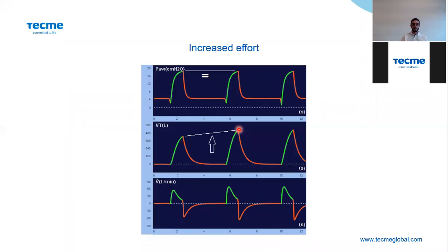So, in some way, you are controlling the pressure, but not the volume. And if you remember at the beginning of the presentation, we talked about that in a pressure mode, the tidal volume depends on the patient's effort. So that's why here the tidal volume increases.